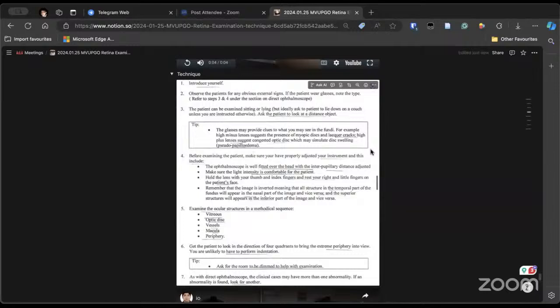This is very important. When a patient comes to your OPD, you examine the patient for xanthelasma, how they are walking. And sometimes a patient might have congenital glaucoma. One eye might be larger. So if you do not see them with the naked eye and directly go to the slit lamp, you might not get the clue. So that is very important.